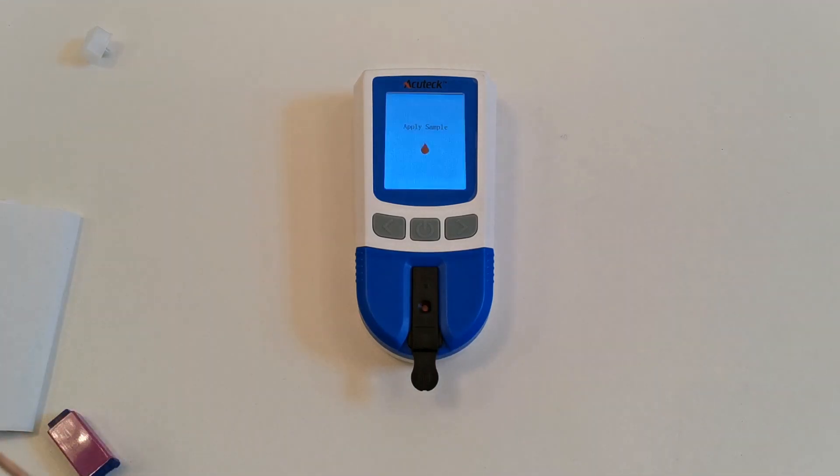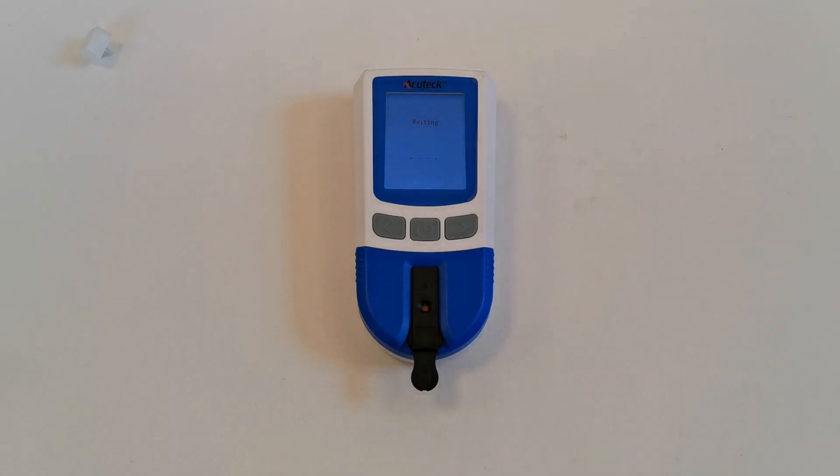The meter will now start to analyse the blood sample and this can take anything up to two minutes. I'm going to stop the video and come back and show you the results when the meter has analysed this blood sample. The key element is to allow that sample for testing to form as naturally as possible without any massage or squeezing of the fingertip.